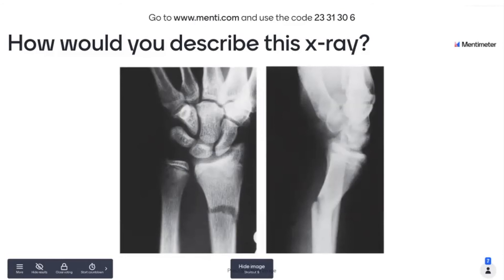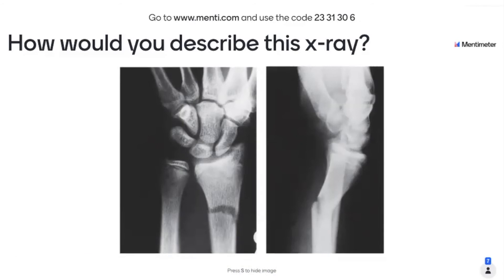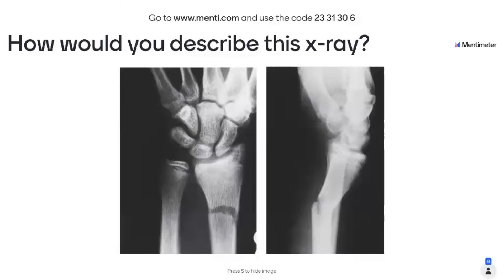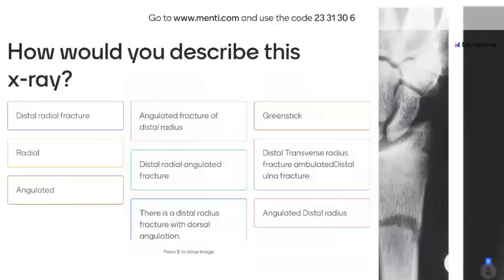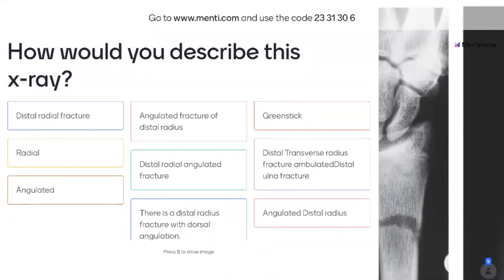I'll just give you a couple of moments. Thinking about our ABC approach, or some of the terms from Plaster of Paris — thinking about that angulation, thinking about displacement. What would you write in the notes, other than distal radius fracture perhaps? Some of the words and phrases people have used: distal radius fracture, green stick, distal transverse radius fracture, dorsally angulated, some displacement — and they are all the right words to be using.